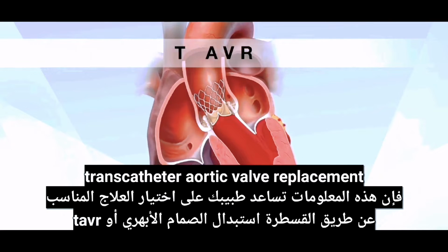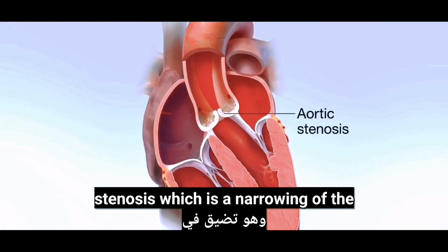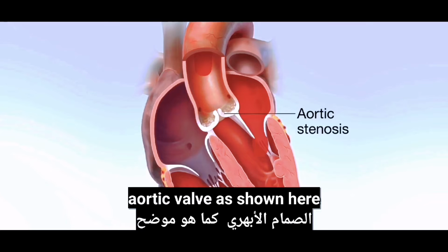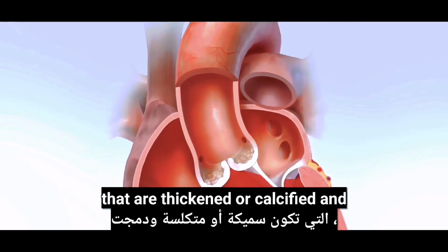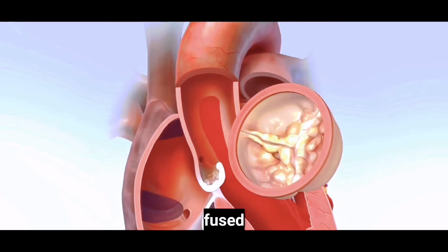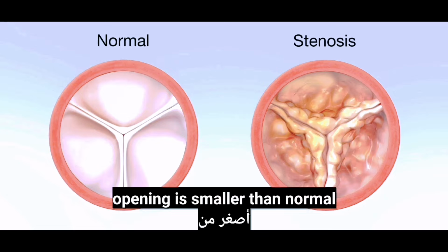Transcatheter aortic valve replacement, or TAVR, is a treatment for aortic valve stenosis, which is a narrowing of the aortic valve, as shown here. The stenosis is caused by valve leaflets that are thickened or calcified and fused. The view from above shows the valve opening is smaller than normal.